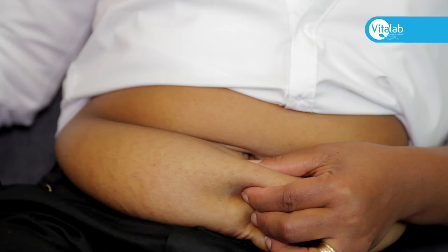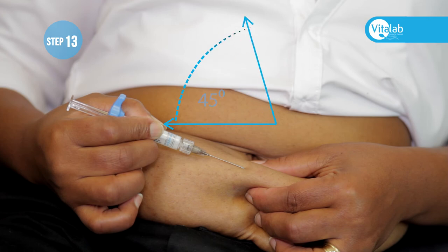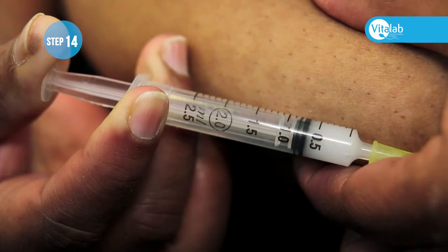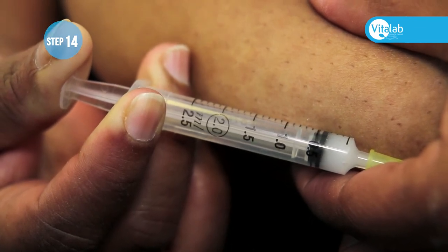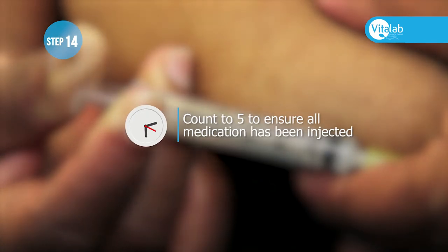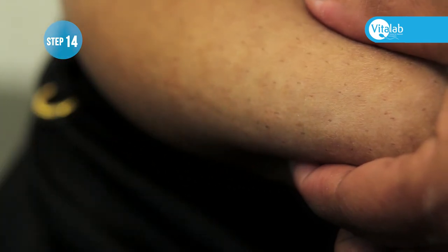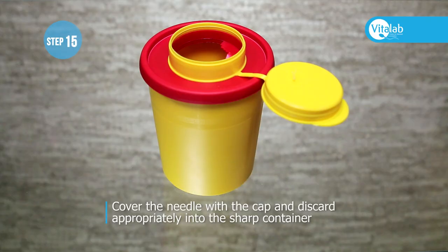Push the needle into the abdomen at a 45 to 90 degree angle — the 90 degree angle reduces post-injection bruising. Inject the medication and ensure that the plunger of the syringe goes all the way in and all the medication is administered. Do not pull the needle out immediately — you can count to five to ensure all the medication has been injected, then pull the needle out. Gently press on the injection area, cover the needle with the cap, and discard appropriately into the sharps container.